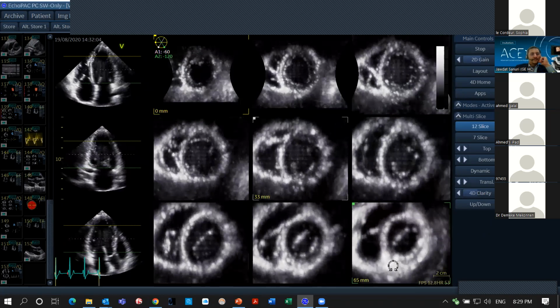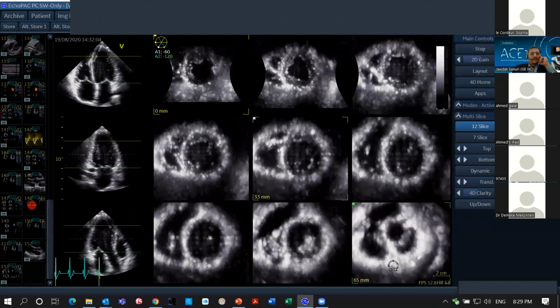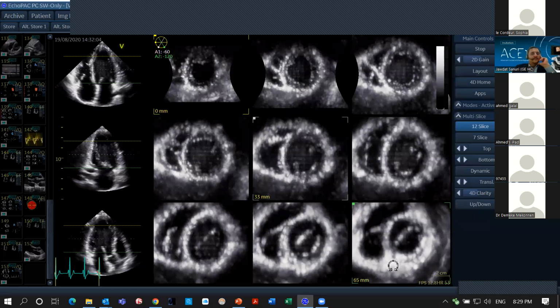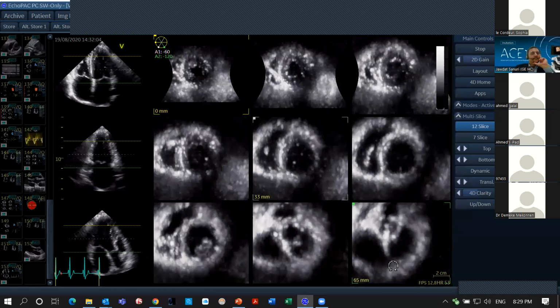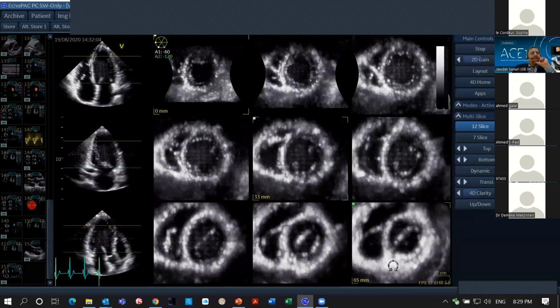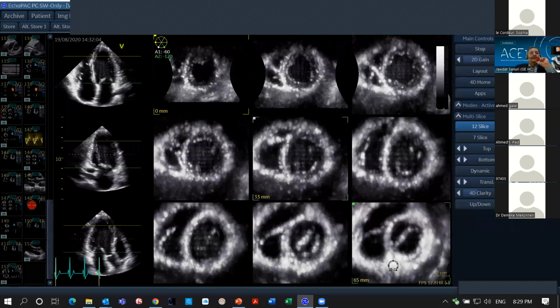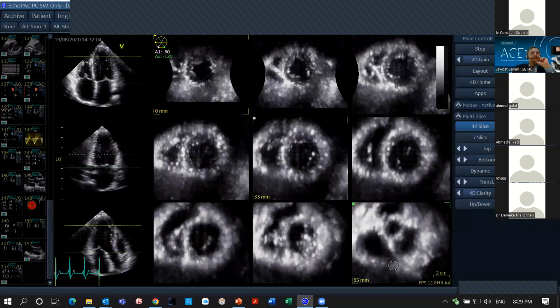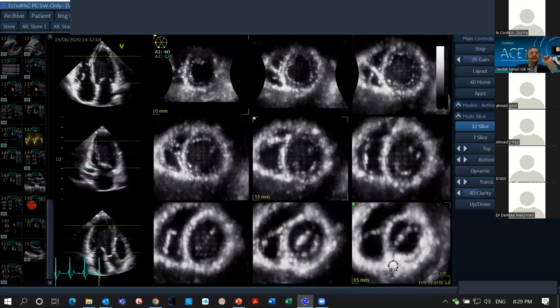But I'm using the flex slice here. If I use this large volume in the LVQ to assess the mitral ring area using flex slice, it's more accurate than the MVQ automated method. I don't know why the number there always comes out odd. Do you have any answer for that?